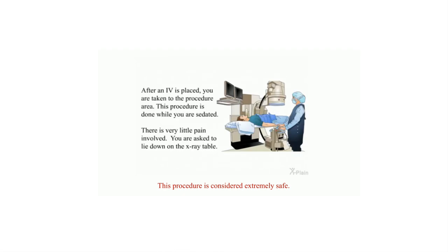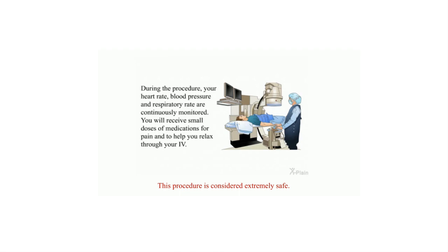After an IV is placed, you are taken to the procedure area. This procedure is done while you are sedated. There is very little pain involved. You are asked to lie down on the X-ray table. During the procedure, your heart rate, blood pressure, and respiratory rate are continuously monitored. You will receive small doses of medications for pain and to help you relax through your IV.